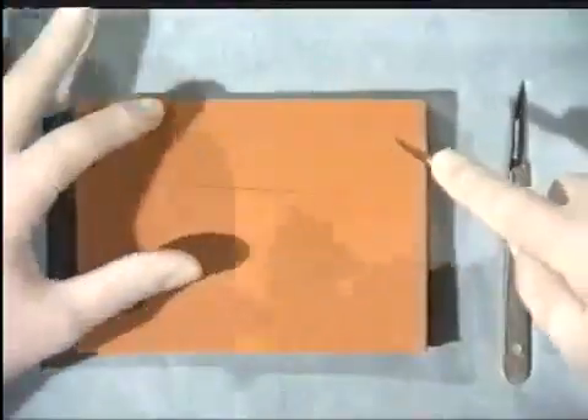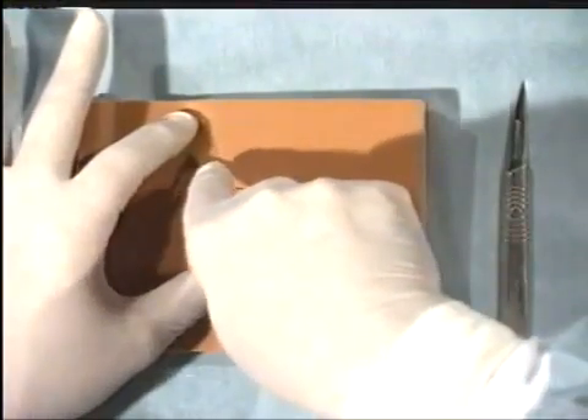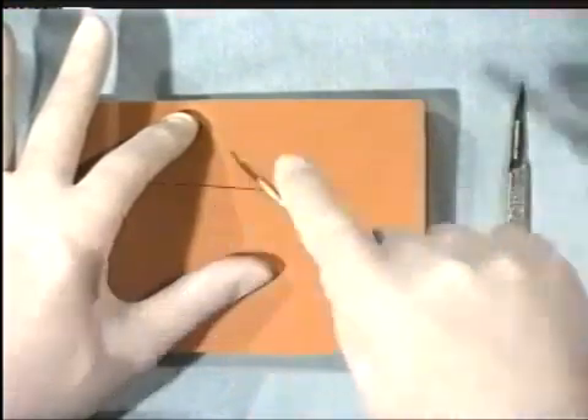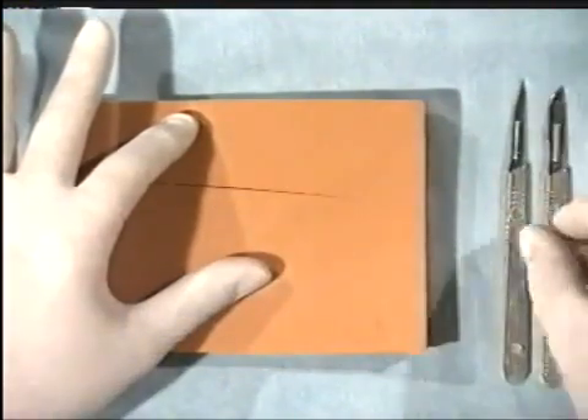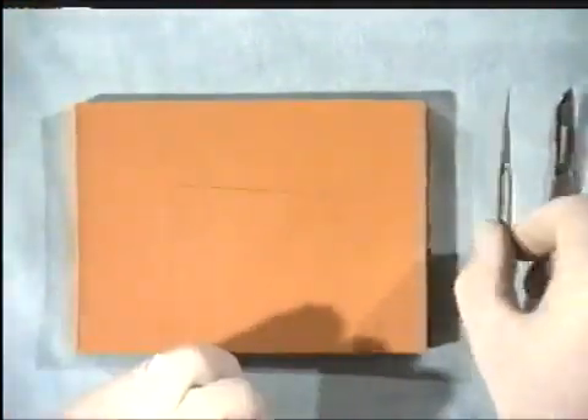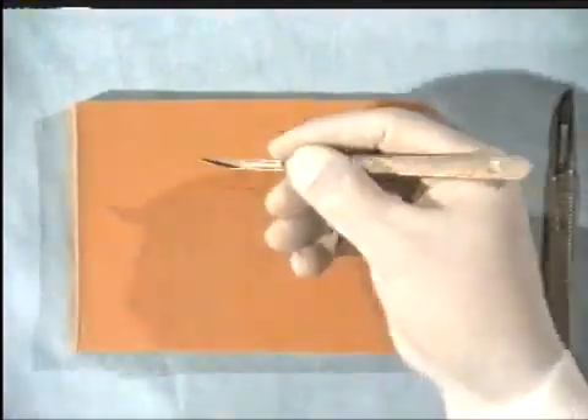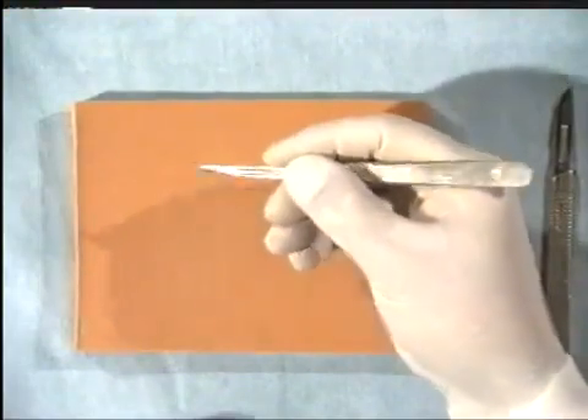Never, ever cut towards your own fingers or thumb, as it may not just be the patient that you cut. When doing delicate work with a fine-bladed scalpel, you may wish to hold it like a pen. Then finer work can be undertaken.